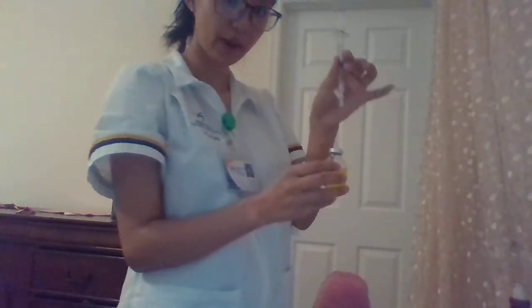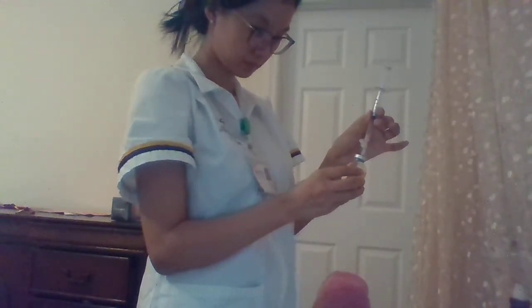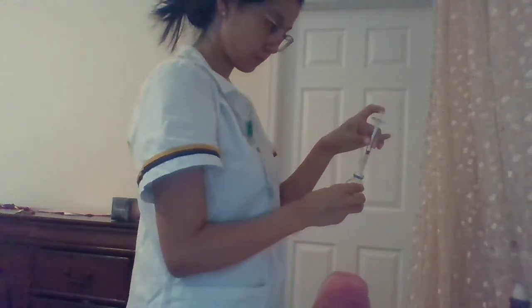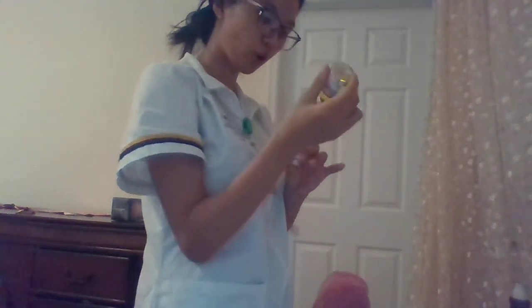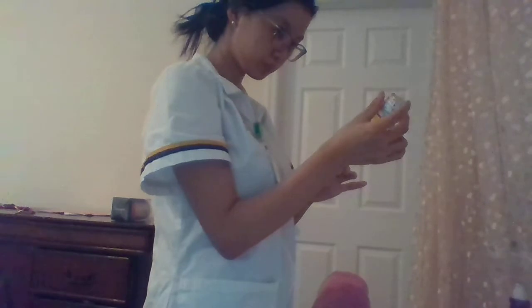It's air to air. I am going to invert the vial and withdraw 0.5 of the influenza vaccine now.